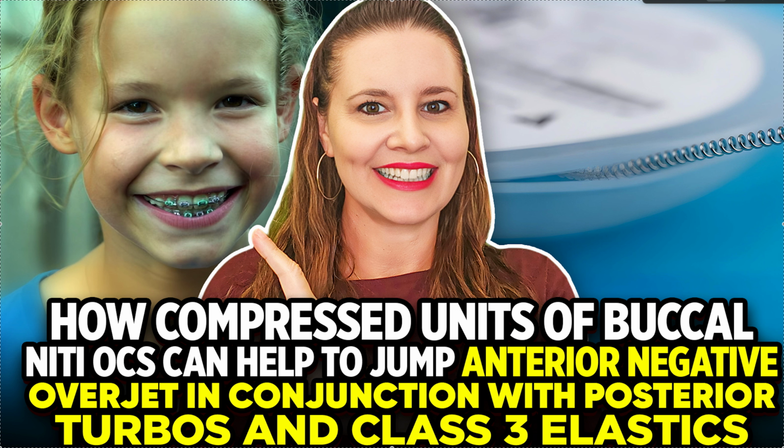And I'm going to give you two scenarios here. In both scenarios, the patient is skeletal class 1. That means we take the Ceph, we run the numbers. I like to run Steiner's. I have a lot of content on reading Cephs in my Ceph playlist.